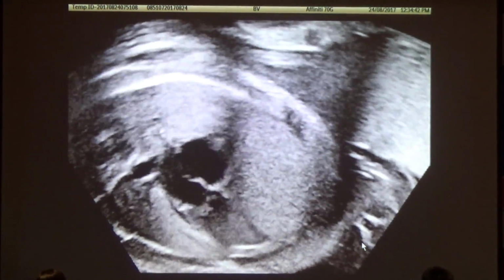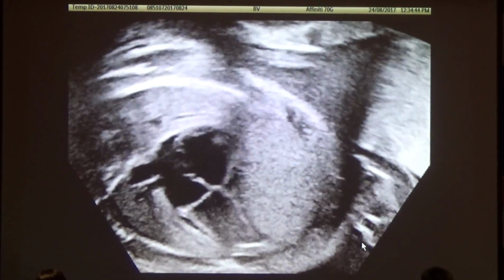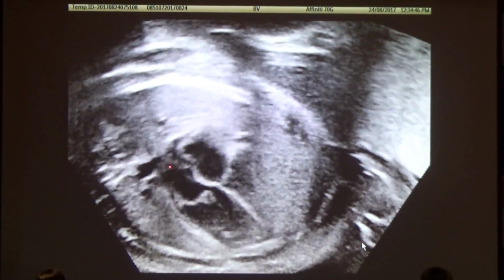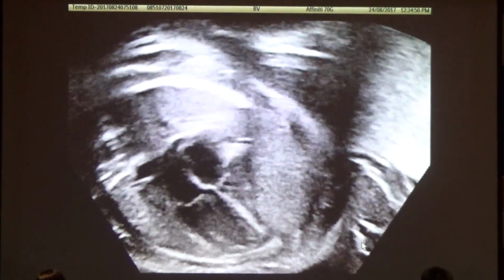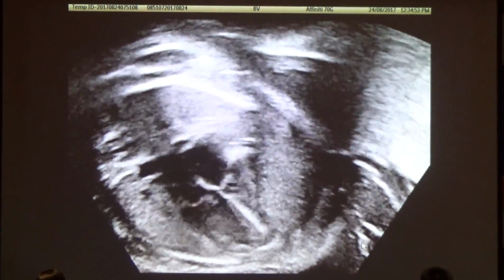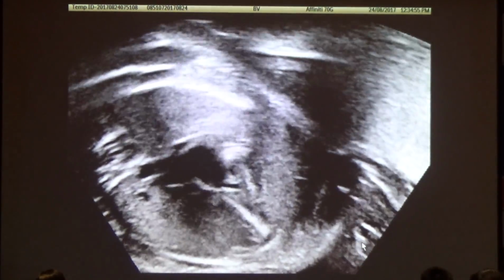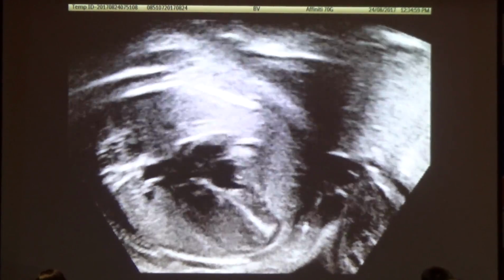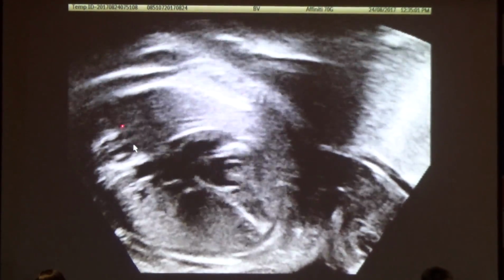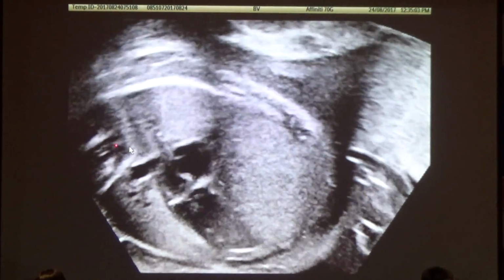Okay, and now we see that. You see, I think that is, although it's flipping, there's a four-chamber view, right? Now, where's the spine? There's the spine there, eh? Let's just point this out for the audience, right? Pointer. Here's the spine. Okay.